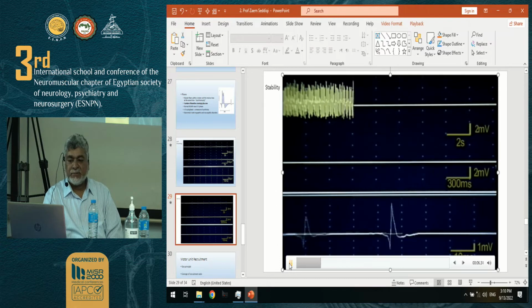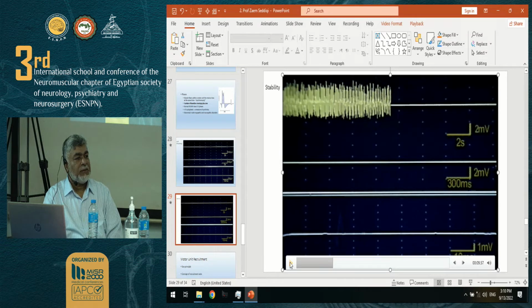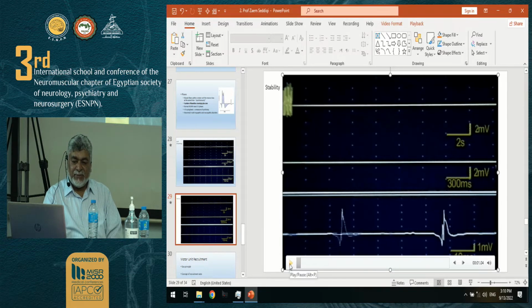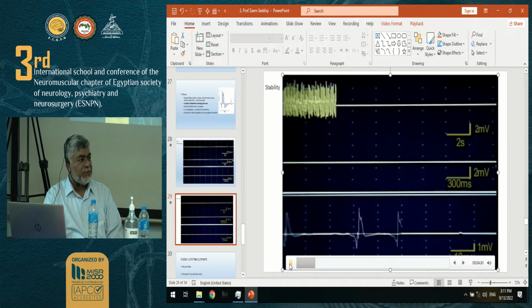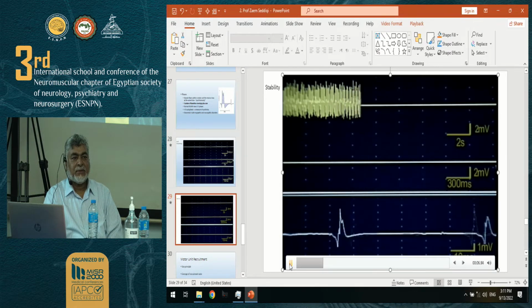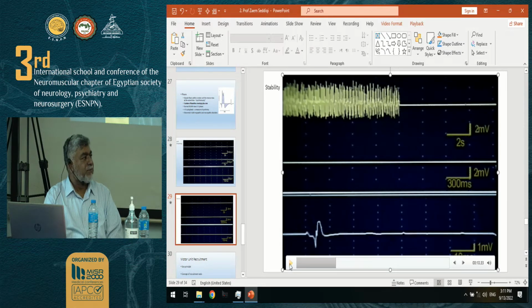What do you hear there? There's something I want to show you over here before telling you. Who will tell me? Okay, close your eyes, guys, and tell me what I'm trying to show you. It's a motor unit. What is that? There's some feature to it, guys.